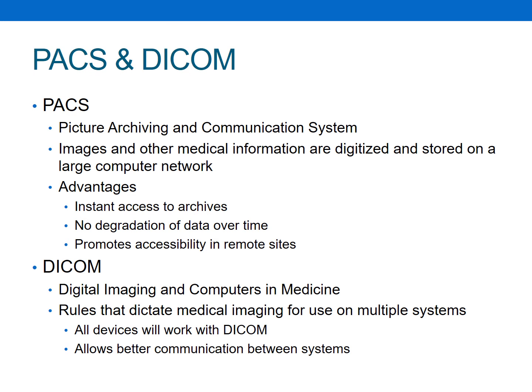So the advantages of the PACS system then is that there is instant access to archives. So not only can I see the pictures that I just took, but I can see pictures from however long ago the PACS system stores. Often it's multiple years worth of images. We also get no degradation of data over the time.